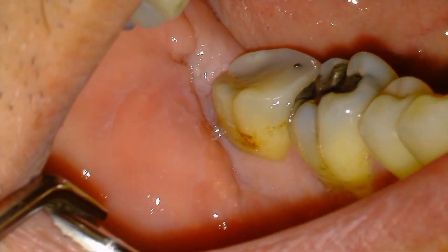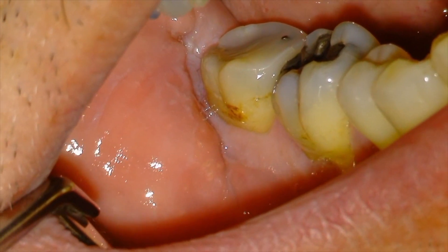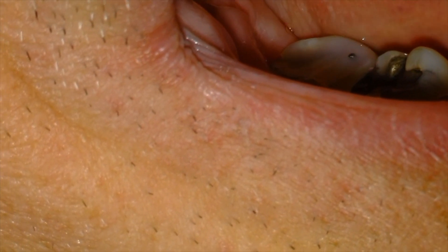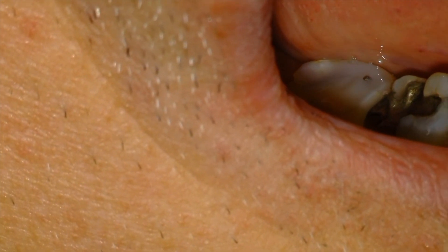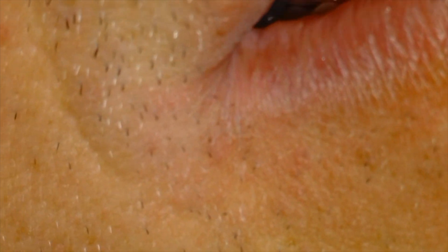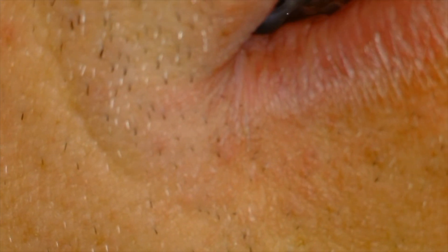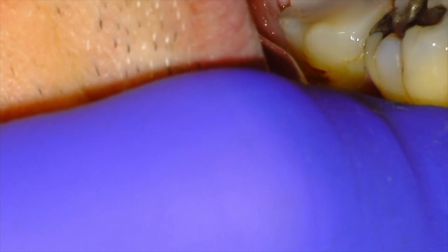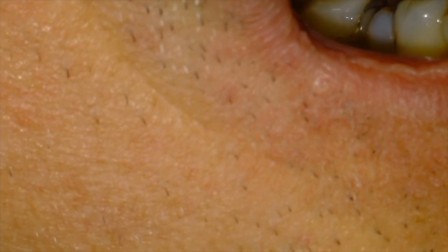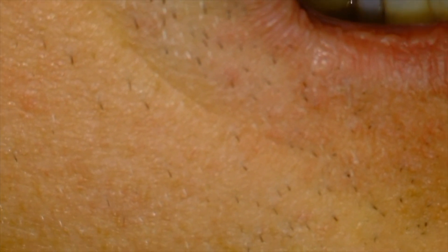One of the difficulties I had capturing is that I always had to have my laptop right next to me, and it's really hard to try to capture — turn your head. I don't have a table next to me, so I'd be turning my head behind me, which made it really difficult to make sure it was in focus. That's another advantage of having the iPhone right next to your eyes — you can see if you're in focus or even on the tooth. I probably have thousands of hours of footage where I'm not even on the tooth. The video feed goes through one of the binos, so it doesn't go through both.